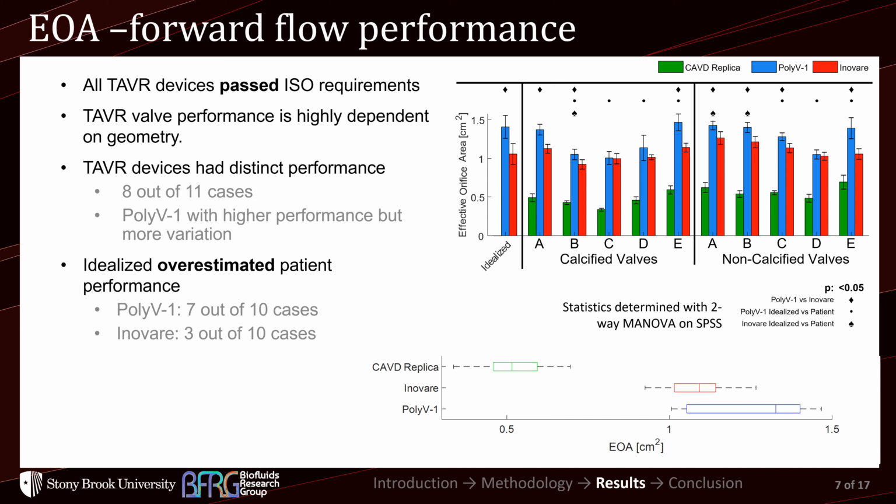So if you were to just follow the ISO standard, the Polynova polymeric valve would look amazing and should perform the best, but in actual realistic scenarios, we learned that we should not expect this in the clinic, and we can actually refine the design at this stage of the process rather than go to the clinical trials and then have to repeat everything all over again, in order to drive even more distinction and innovation.